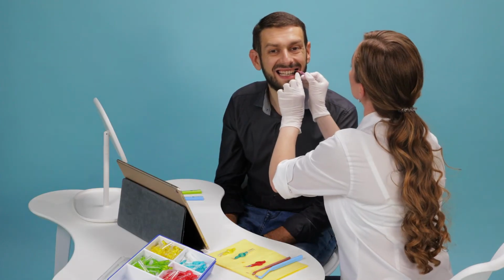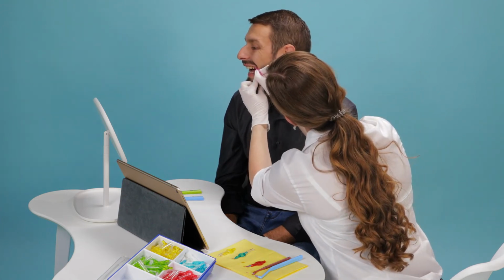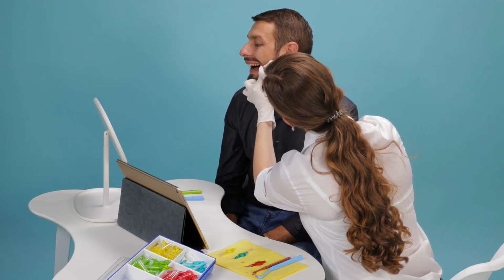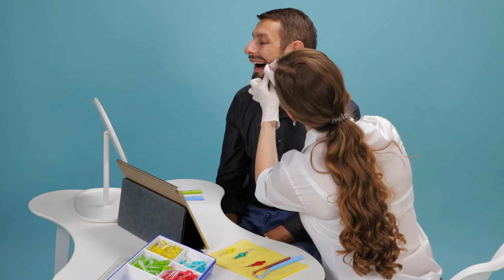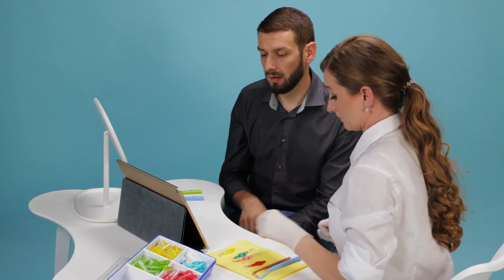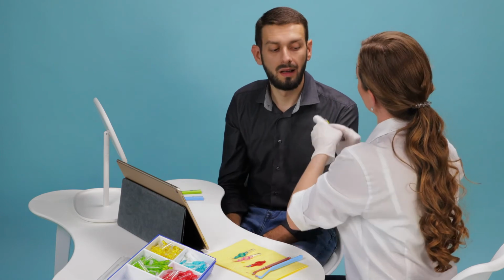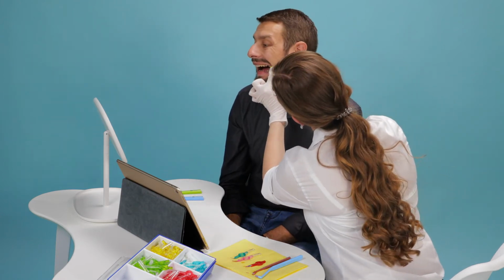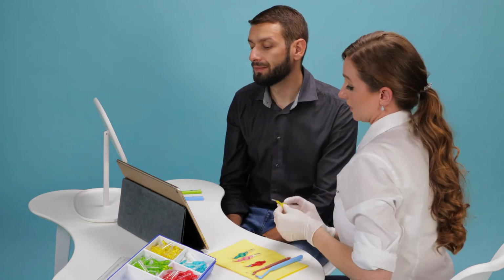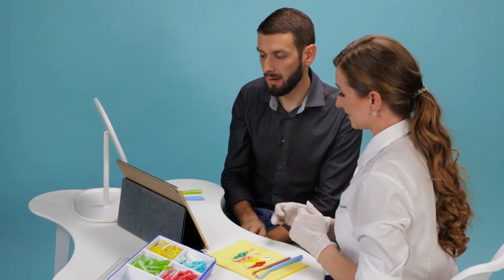We continue on to the upper left sextant with Edward watching the technique demonstrated. I then return to show him the bleeding present after removing the interdental brushes. He then inputs his interdental brush size into his score.